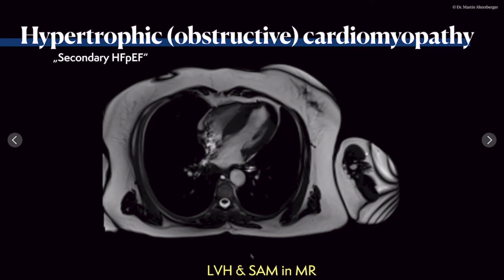So these patients, of course, need an MRI to quantify the risk and to see if they are more likely to have a possibility of sudden cardiac death. But it also shows very nicely how we can compare two imaging modalities. So echocardiography and MRI, especially in these cine loops, you can compare the images and the findings quite nicely. But this will also be a topic when we discuss left ventricular hypertrophy and the thickened left ventricular walls.